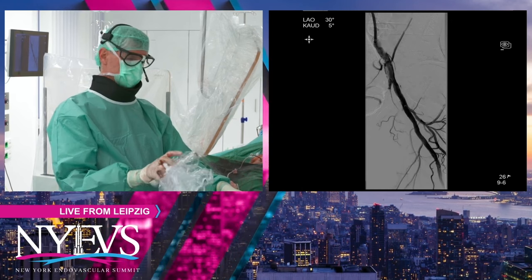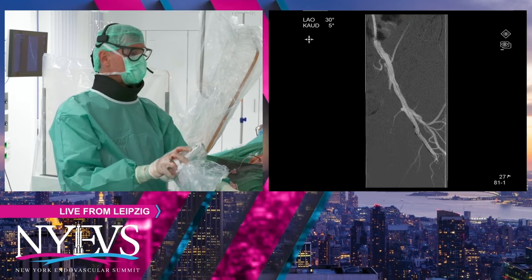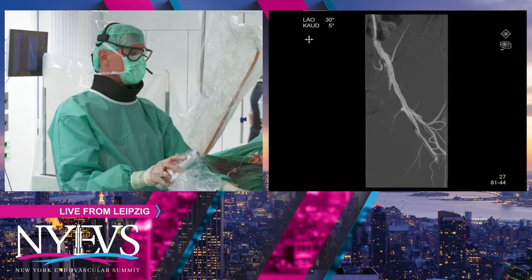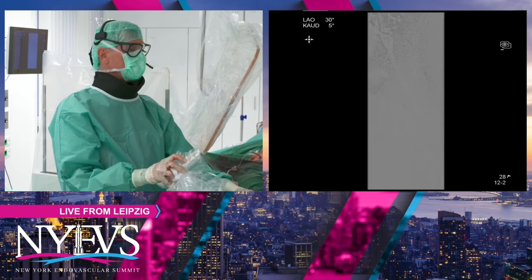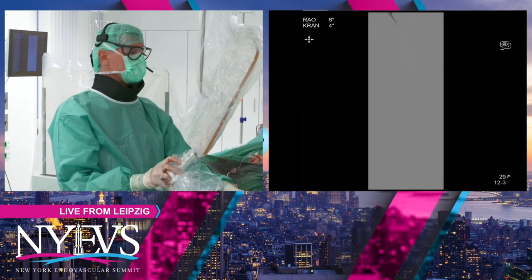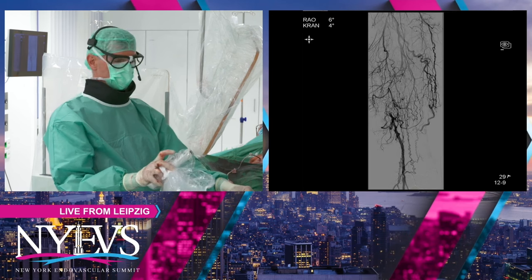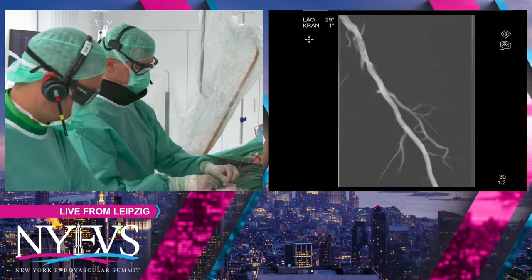The flow is still a little hampered because of the blocked filter, so we took the filter out, which was quite easy. First I wanted to check the outflow, so we didn't sacrifice any collaterals. And now I wanted to show you once again the IVUS of that lesion.